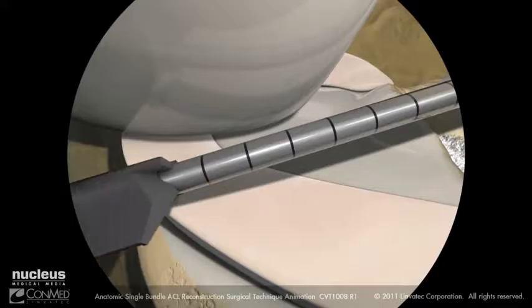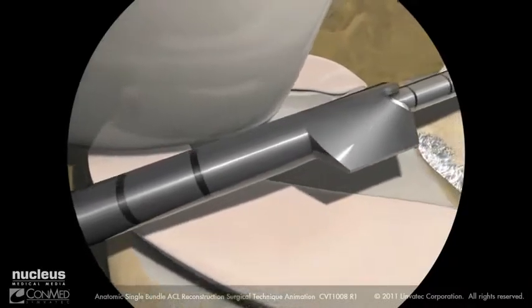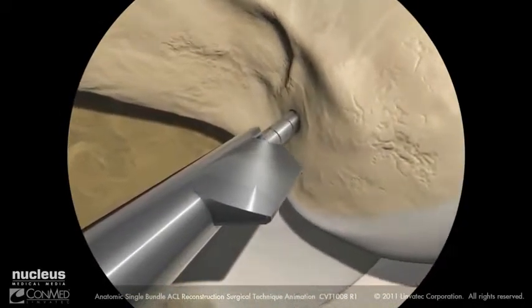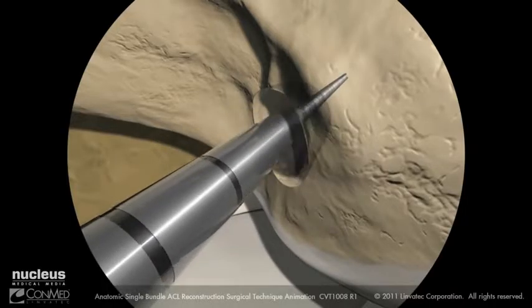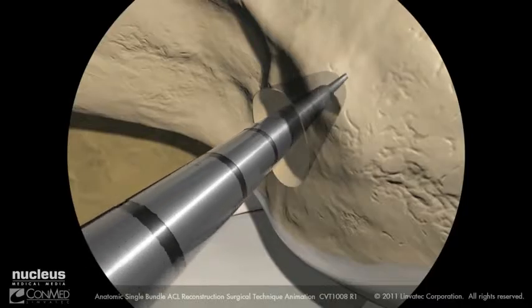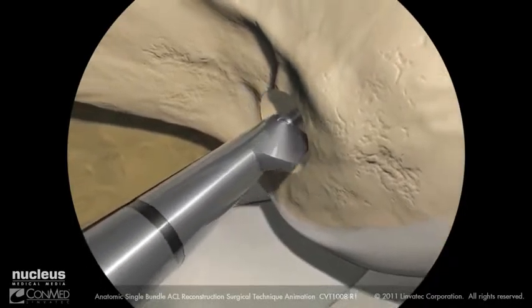Insert the monofluted sentinel drill bit over the guide pin through the accessory anteromedial portal with the cutting edge facing away from the femoral condyle and advance the drill bit to the femoral ACL footprint. Using a piston-like back-and-forth motion, advance the sentinel drill bit to the desired depth, cautiously, to prevent blowout of the lateral femoral cortex. Pull the drill bit back slowly until the blade is visible in the joint space.